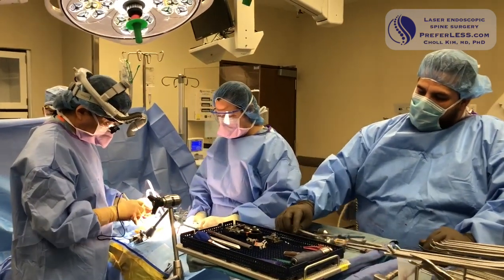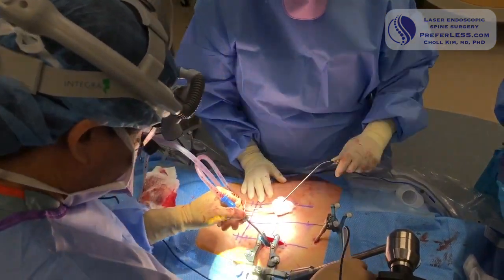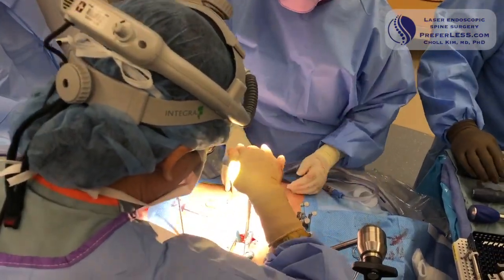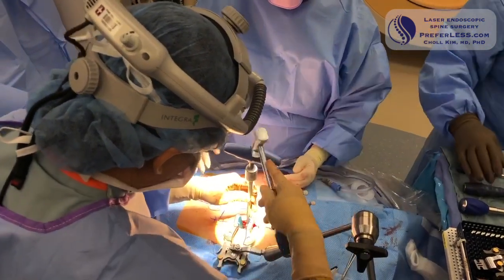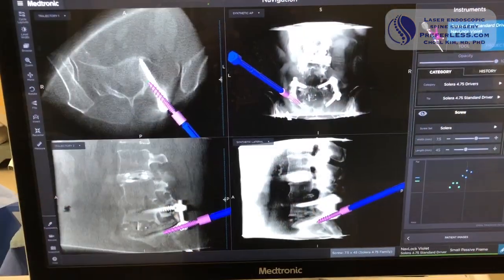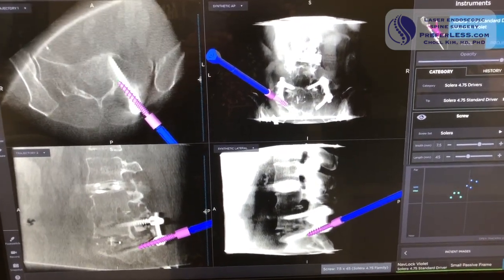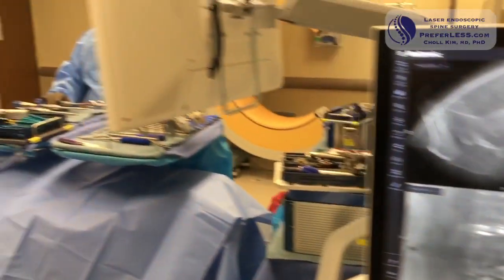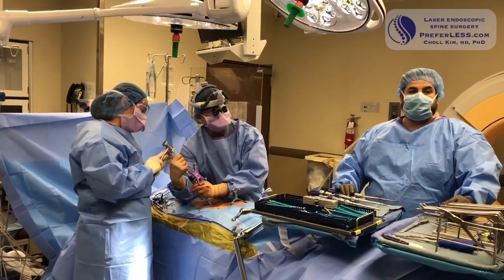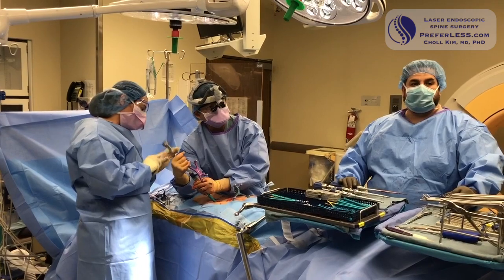Taking out the hardware. Nut driver. Mallet. Just a little bit of play. Luckily, the knuckle. Okay, mallet. Okay, so tap that as I turn it. Ready, go. Keep going. Sorry, I'm afraid I'm going to hit your knuckles.